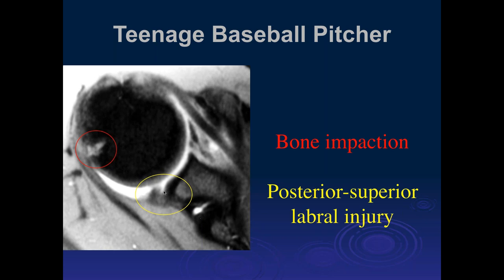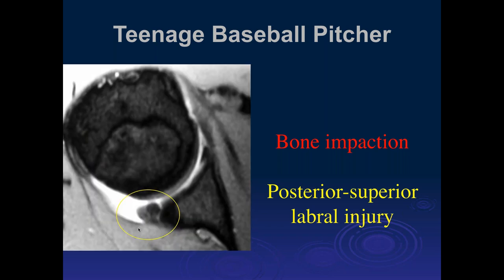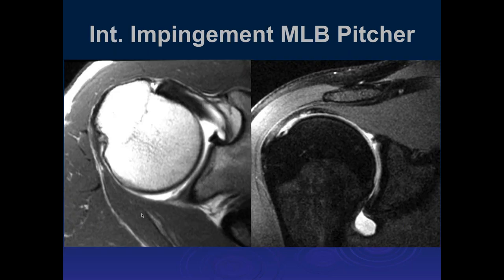There is abnormal signal within the labrum and displacement of the labrum. The next cut shows the labral tear as well as abnormal morphology of the posterior superior labrum. Look at the more normal labrum here — this is what the labrum should look like — here it's all beaten up. This is due to posterior impingement in this young athlete — a teenager. That's posterior impingement.